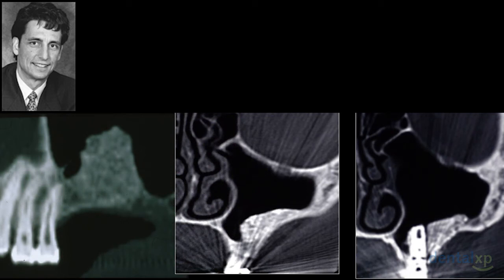These are a few cases that I've inherited where the post-operative CT scans have shown us very interesting findings. This mound is a great volume of bone, but from a three-dimensional standpoint, there certainly is not going to be a lot of stability. So I think with most of our sinuses, we really need a preoperative and a post-operative CT scan so that we can evaluate for pathology and evaluate that you've been very effective with your bone grafting.